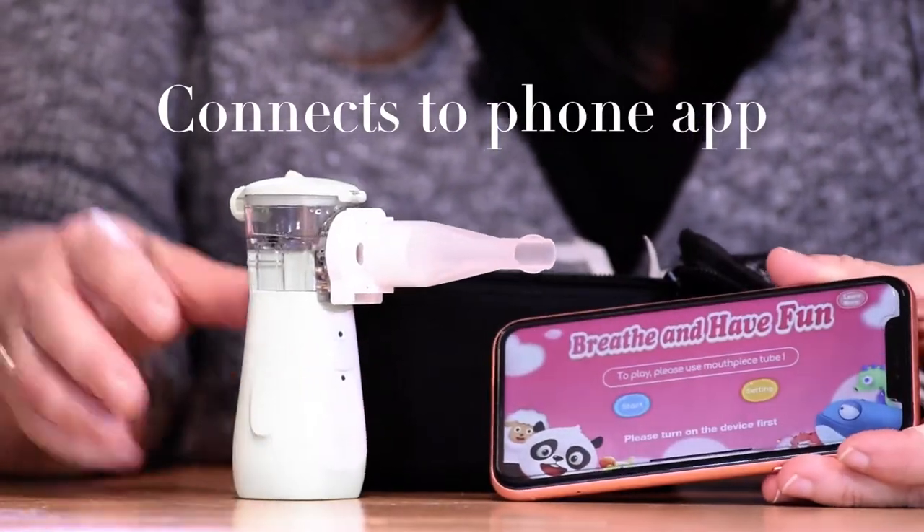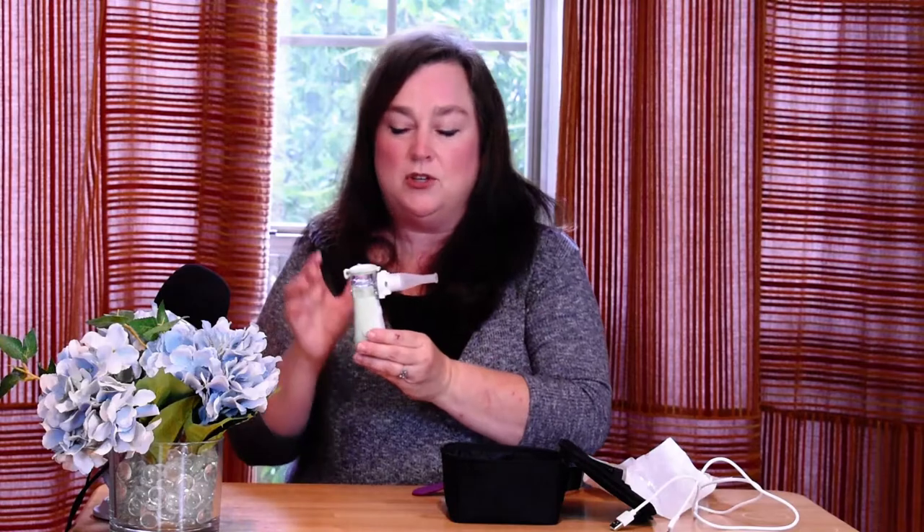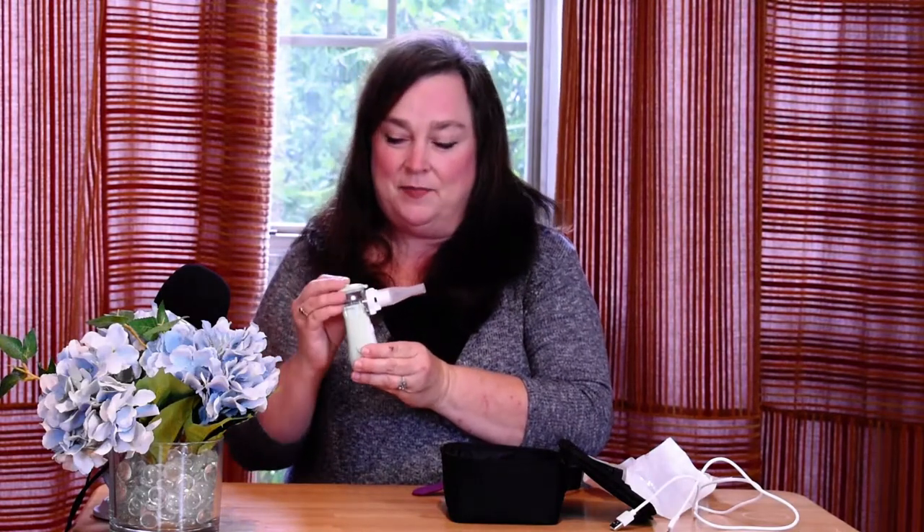The interesting thing about this particular device is that it also connects to your phone. This model will help you to remember to take your medication, and it coaches you through how to take a breathing treatment — so you take the same size breath each time you draw in through the device. It helps you get the same amount of medication in each breath, and also helps you not to waste any as you're taking a treatment.